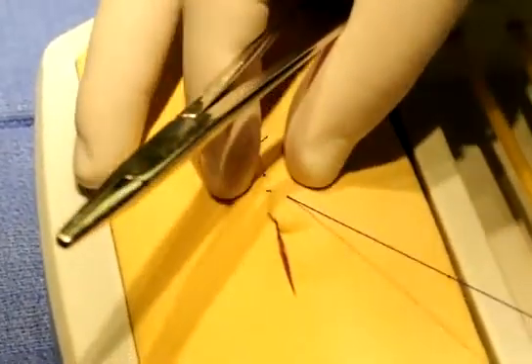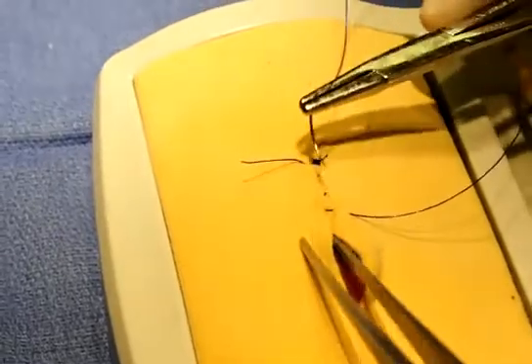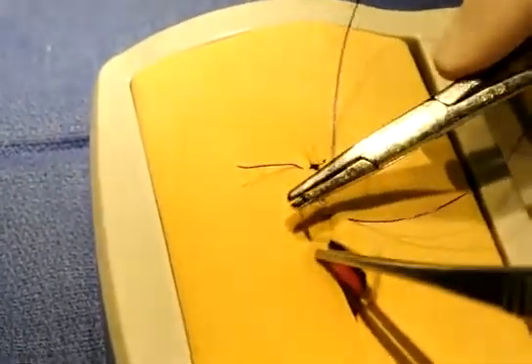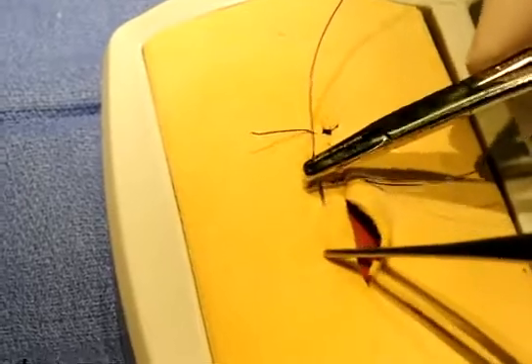Now, if I want to have an inverting pattern that looks exactly the same, but the suture bites do penetrate the mucosa, that's called a Connell. So I'm going to take these a little further from the cut edge just so you can see that they're different. And I'm going to purposely penetrate all the way through with the needle, all the way through into the mucosa, take a full thickness bite, and continue inverting. So now I've changed my Cushing for a Connell.